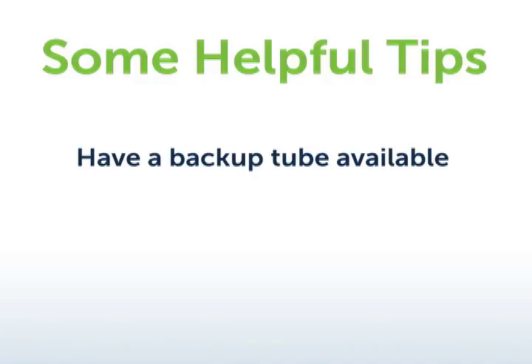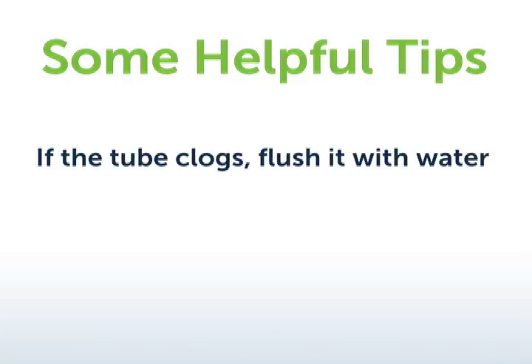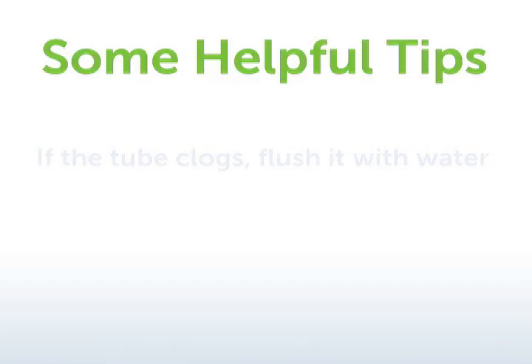It's also a good idea to have a backup tube the same size as the one that's currently in place, especially on trips and vacations. If a tube becomes clogged, do not insert anything rigid into it, as it may interfere with the proper functioning of the tube. Simply flush it with water. If this does not resolve the problem, consult your healthcare professional for help with declogging.